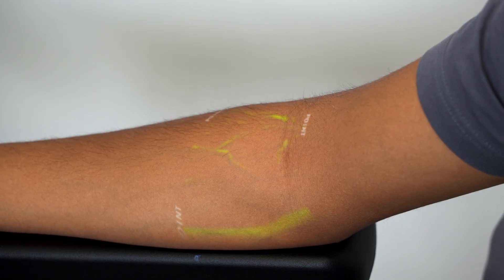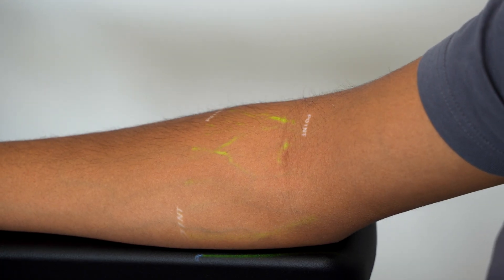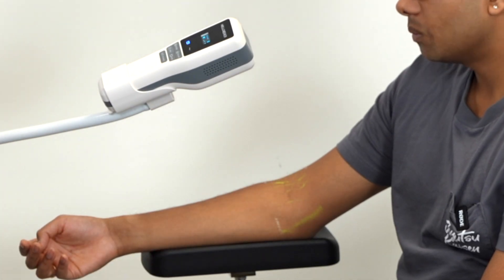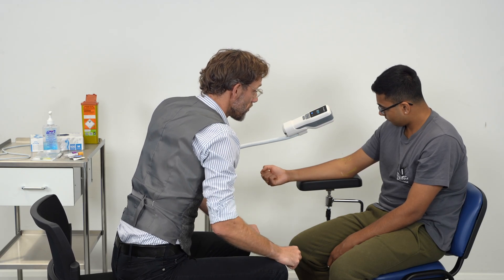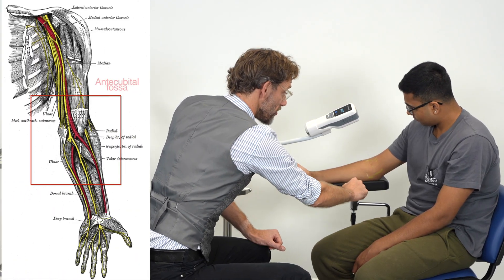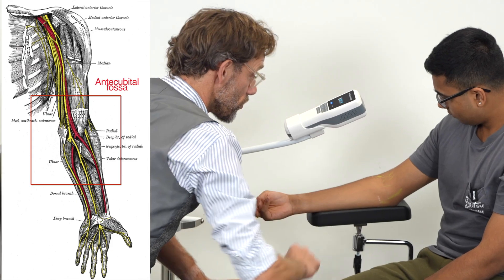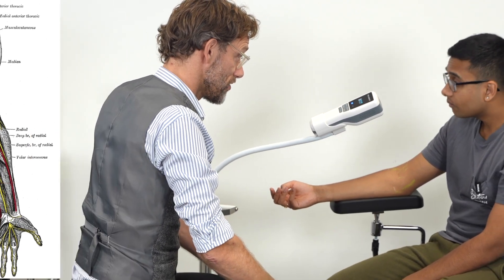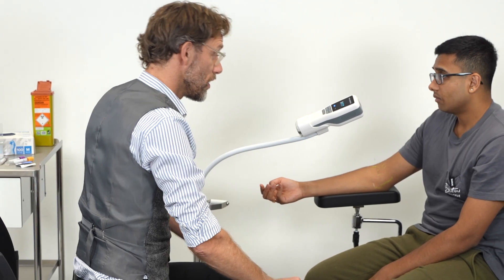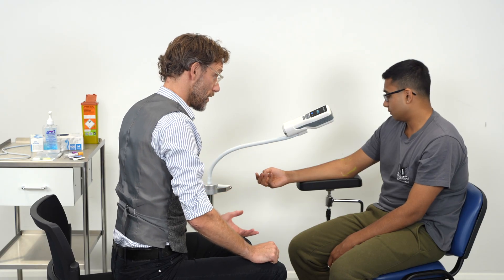I'll bring this over. So these green lines are highlighting where you've got blood vessels in your arm. We've got some big ones running across your elbow here — the antecubital fossa. We'd often look to try and take one from there first, because that's one of the easiest places to take blood. Would you be happy for me to try that?